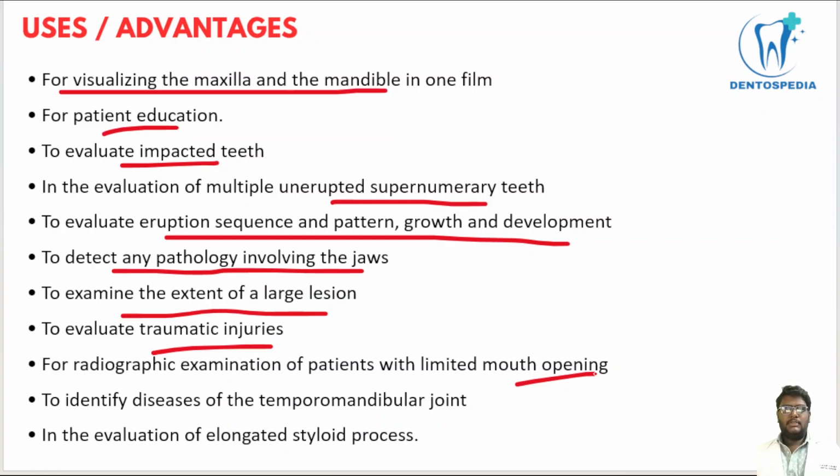and for those patients who have limited mouth opening. In intraoral projections the patient has to open the mouth to a certain level, but in OPG we don't need much mouth opening. So it is very beneficial for patients who do not have much mouth opening.